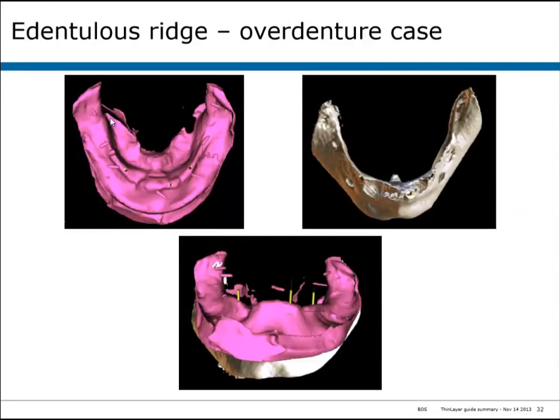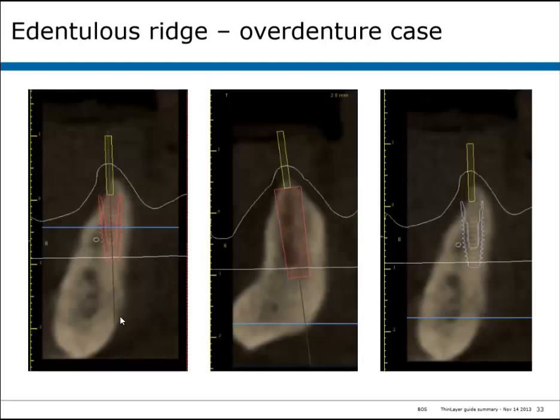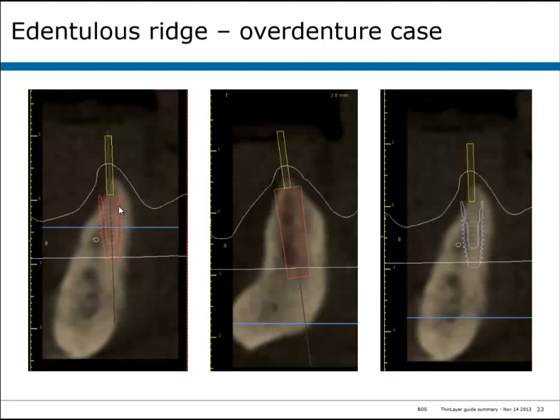Finally, for an overdenture case, an impression of the ridge was taken and merged with the patient scan. In the cross-sectional view — critical for an overdenture case — the outline of the soft tissue ridge is superimposed on the hard tissue. This allows implants to be placed through the apex of the soft tissue ridge rather than through the lingual, which would have been a surgical mistake requiring a thicker lingual flange to accommodate the attachment housing. It's extremely common in the lower anterior region for the soft tissue ridge to be anterior to the hard tissue ridge, which can result in a surgical error if the implant is placed based only upon bony anatomy.